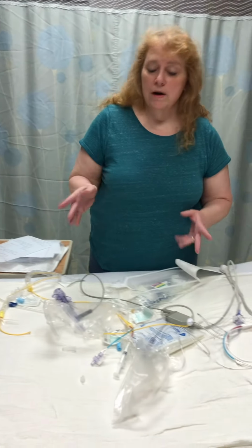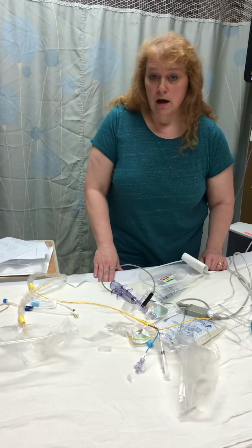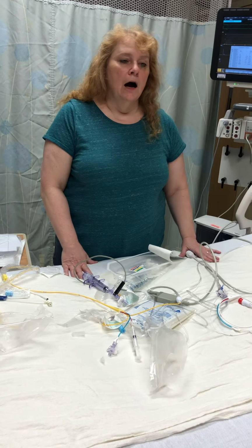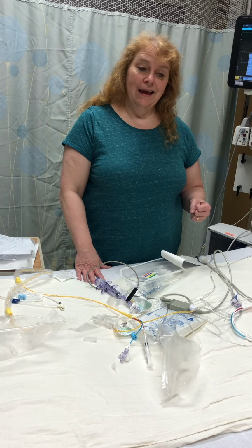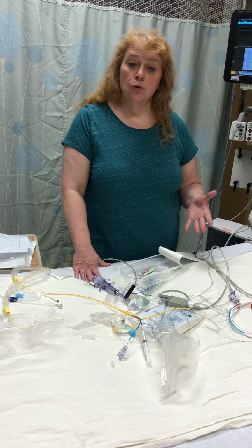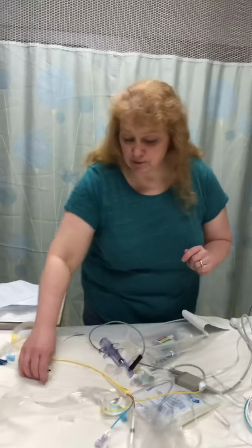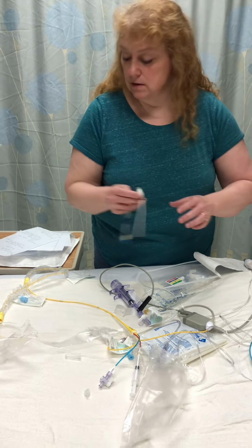Okay, so one of the next things we're gonna do is if we are going to discontinue the swan, we need to double check and make sure we have the order, obviously. And in our order, we wanna know, are we gonna take out the swan and the cordis, or are we going to leave the cordis? So I'm just going to go through if we would take out the swan and leave the cordis.